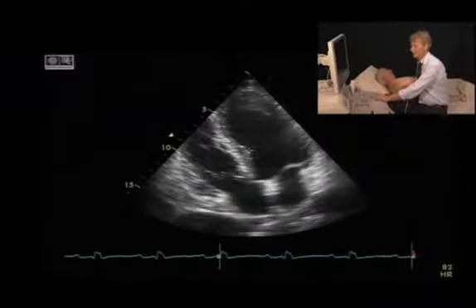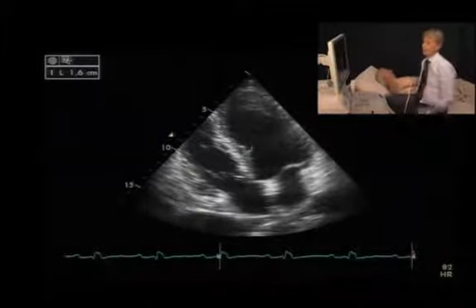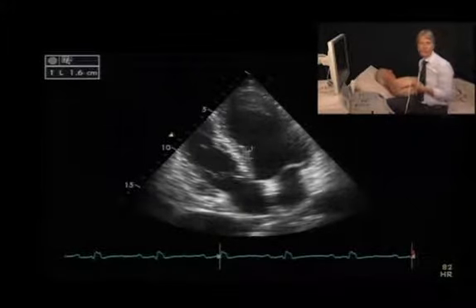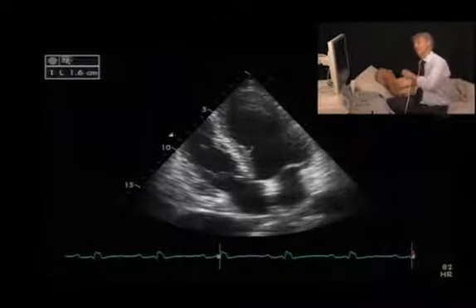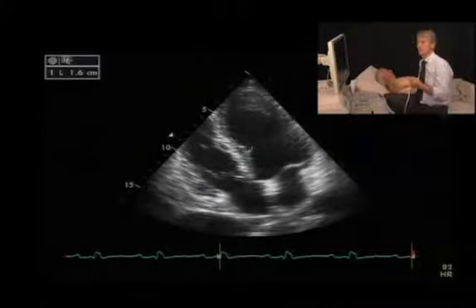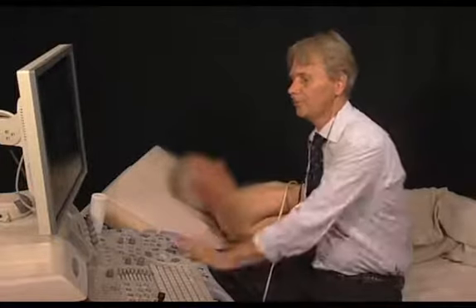Then I perform a measurement of the septum, which I would perform in a region of the septum which is located where you would also measure the M-mode. So it's between the mitral valve and the papillary muscle. However, I would avoid measuring the maximal thickness if the patient has prominent mid-ventricular septal hypertrophy. So I would then measure somewhere below or above this region.